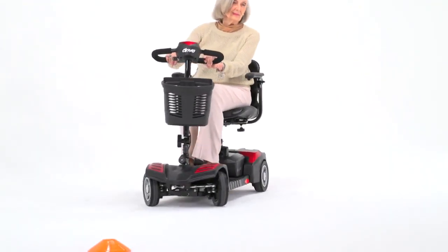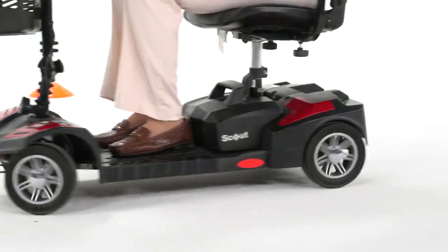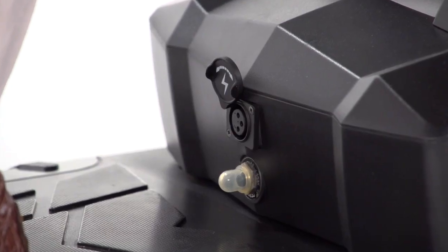With the Spitfire Scout Deluxe 4-wheel version, you get excellent stability when traveling over outdoor terrain. And when the battery gauge shows the need for recharging, it's simple from the port on the battery pack.